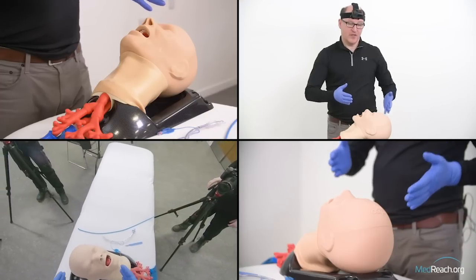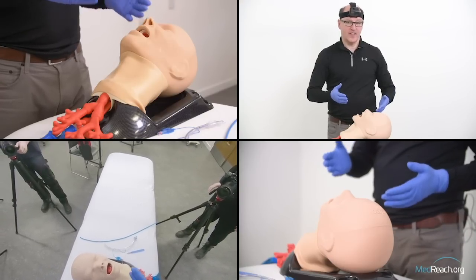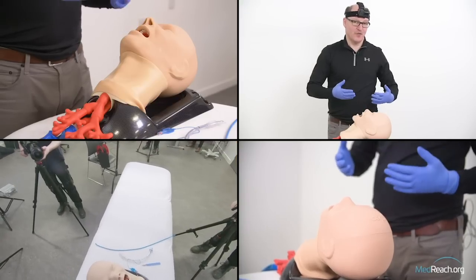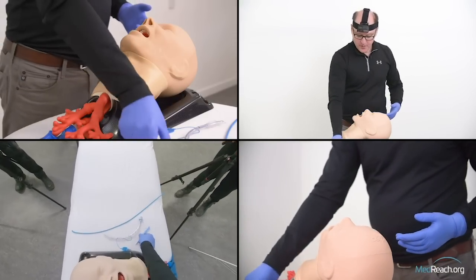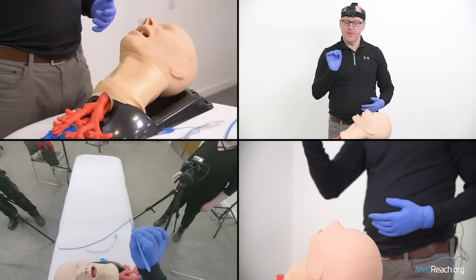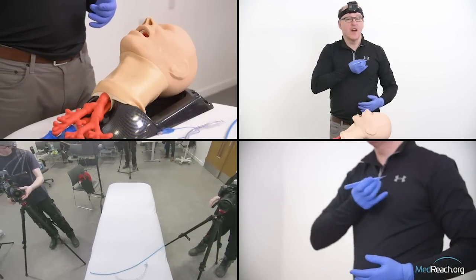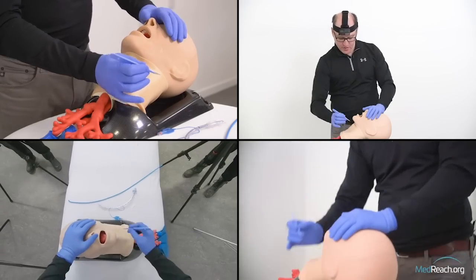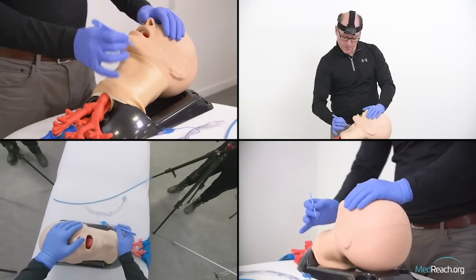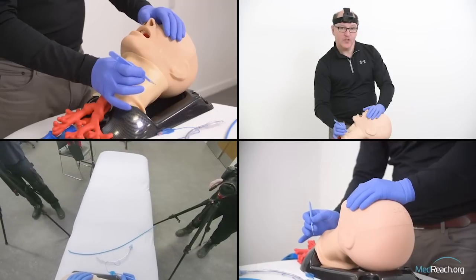First, it's important to be on the right side of the patient. I am right-hand dominant — I don't think I could do this procedure with my non-dominant hand. I want to be to the patient's right, holding the scalpel close to the blade, with my hand stabilized on the patient's sternum — not in space, but with what I call sternal stabilization.